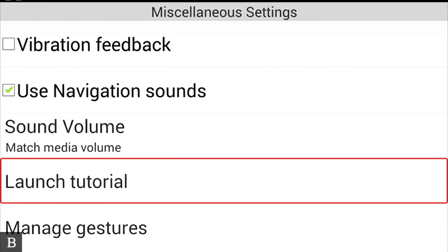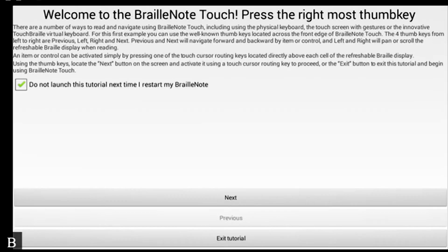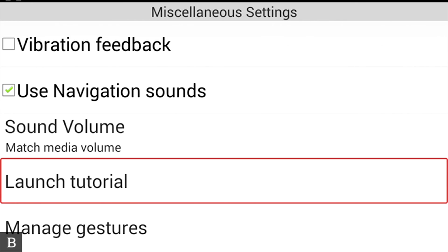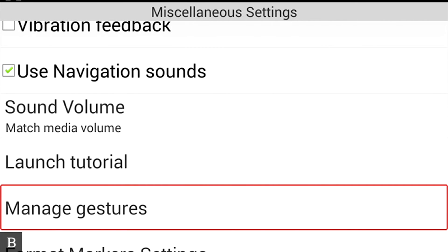Launch Tutorial: when the BrailleNote Touch first turns on, you're introduced to the Keysoft tutorial, which is a fantastic way to get introduced to the device and pre-configure your primary language profile, literary Braille table, and preferred voice. If you ever want to revisit the tutorial, you can activate this option and it will walk you through the entire tutorial again. Next is Manage Gestures, which allows you to configure touchscreen gestures — such as explore by touch — to perform different actions.